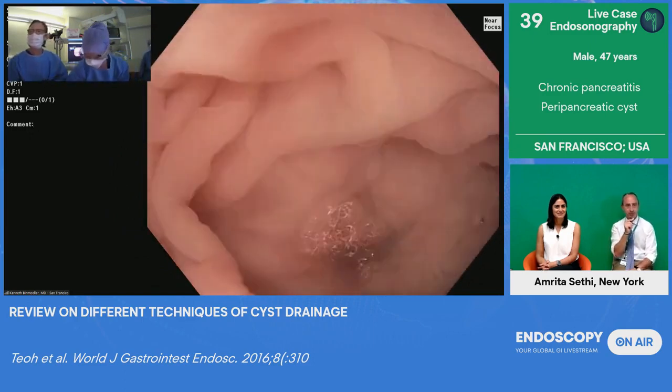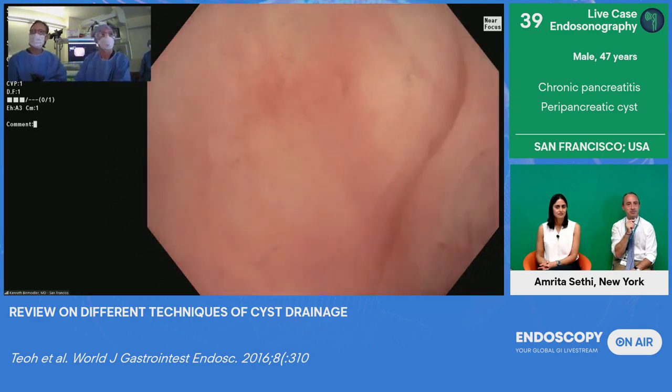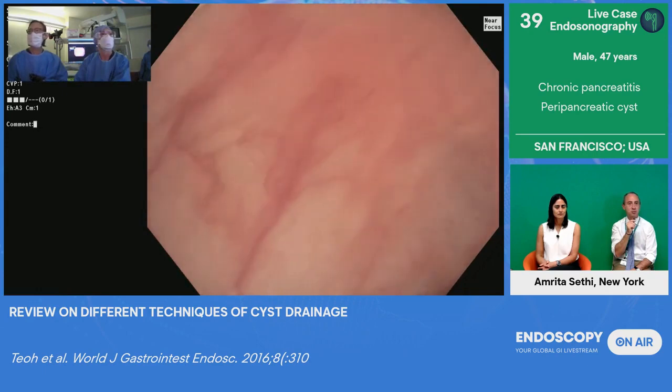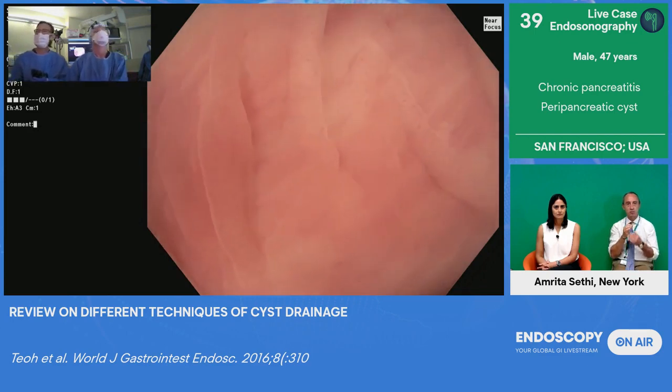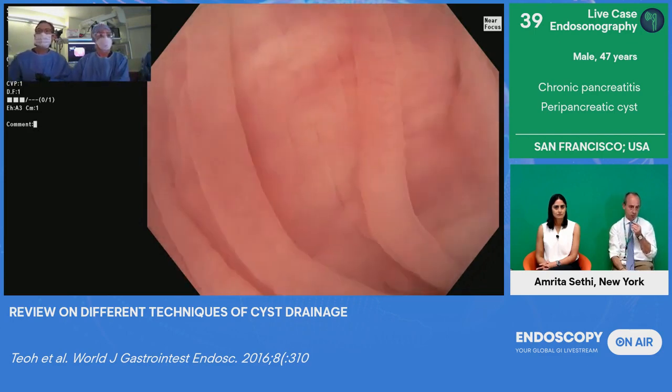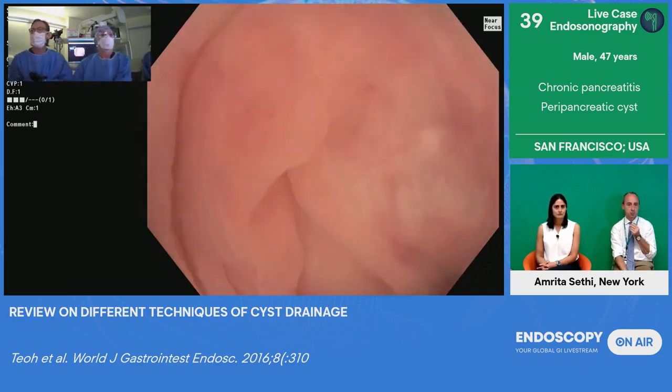Yeah, so I've just inserted the adult colonoscope HD with near focus capability. And I'm using the water exchange method. It's actually saline exchange because we're using saline. And the gas is turned off. So I'm doing the whole colonoscopy underwater now.